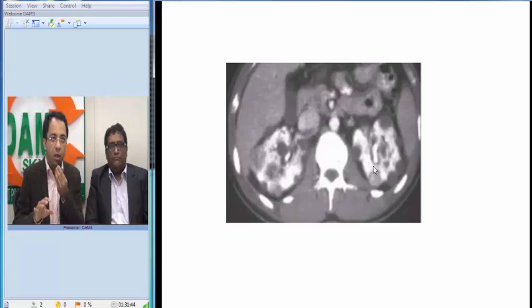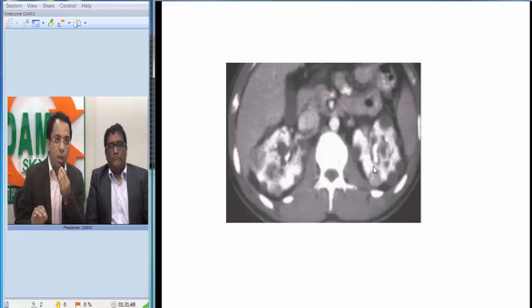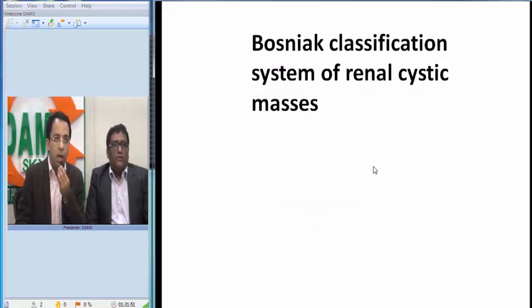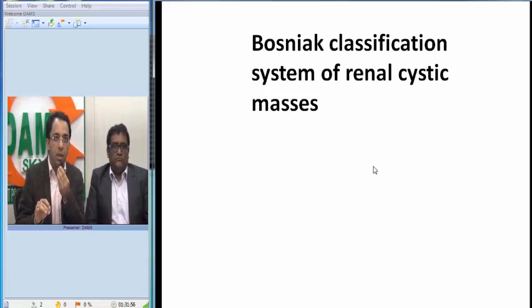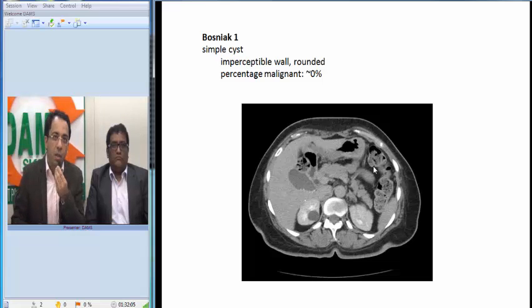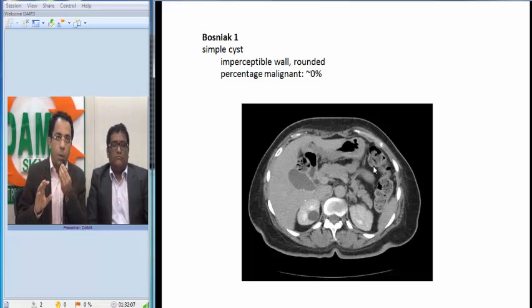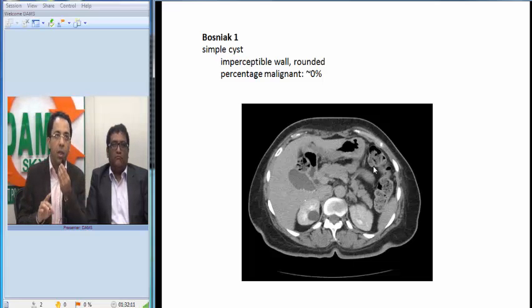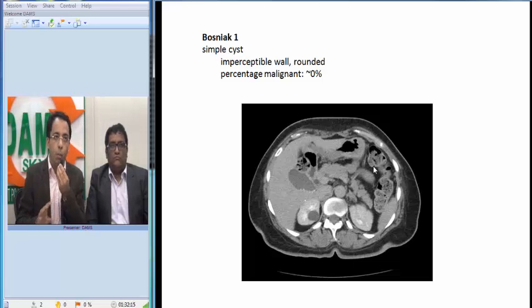Before giving my differential diagnosis, whenever we look at a renal cyst on CT, as a radiologist we are supposed to classify them using a system called Bosniak. This Bosniak classification is used on CT scan to classify renal cystic disease. Let me show you an example.